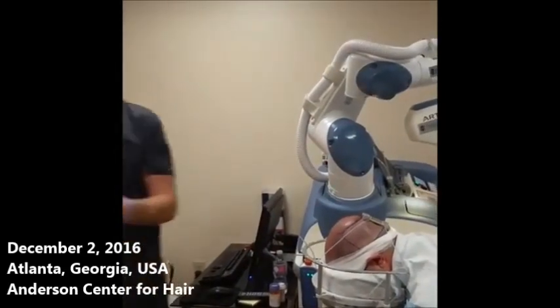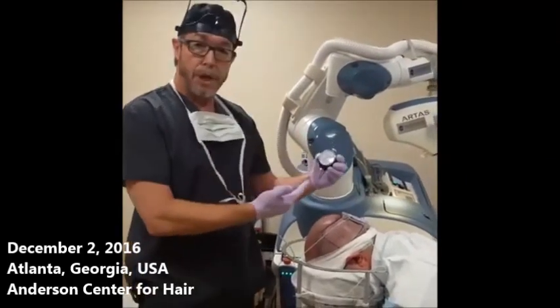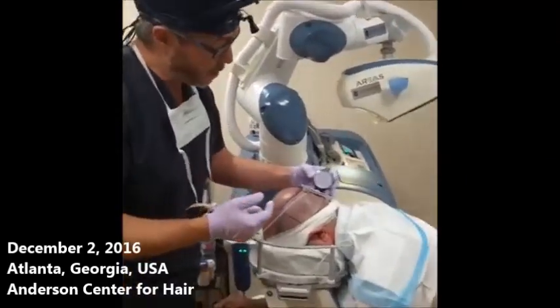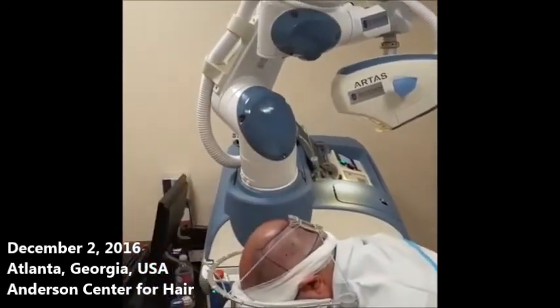As I like to do, we take a little piece of glove to keep it sterile, and we're going to use our durometer and check the pressure. It's 43 pounds per square inch of tension, which is excellent.